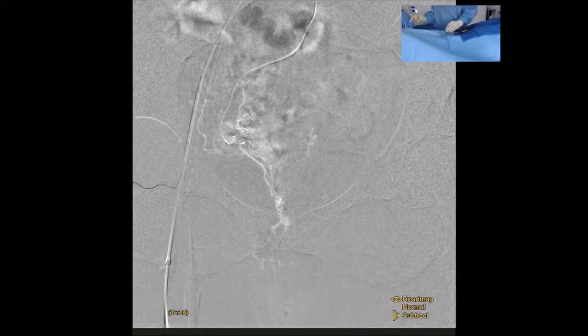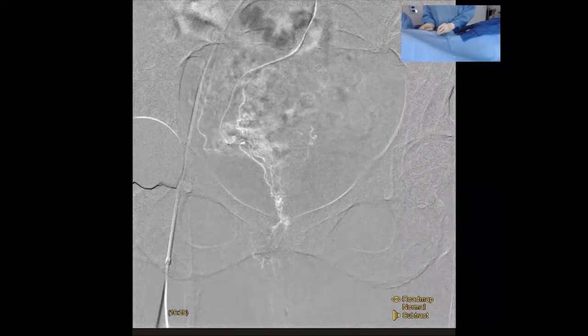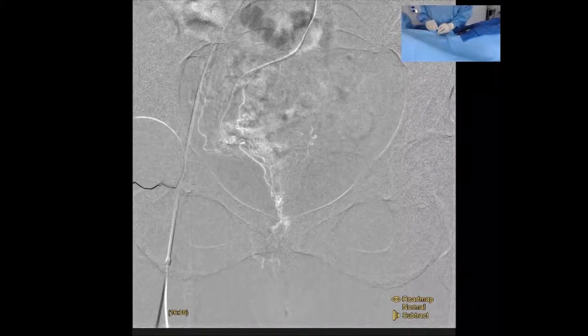All right. Now drop the coil here. Ready to go through our coils here. So push that in. Which coil did you select? Yeah, so we're using the Boston Scientific Interlock coils. This is a 2 millimeter coil by 6 cm in length. And so it's nice here. We'll be able to deliver this coil right in there, and we'll hold some forward pressure on it so that coil doesn't come back on us.